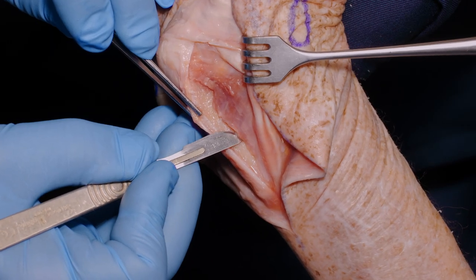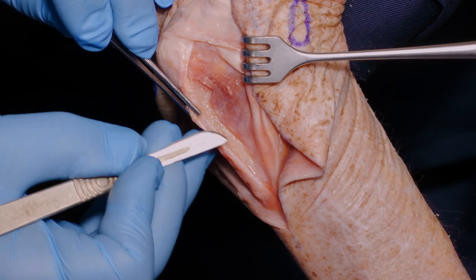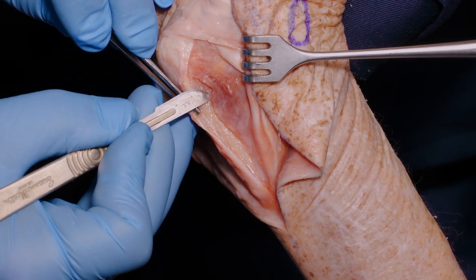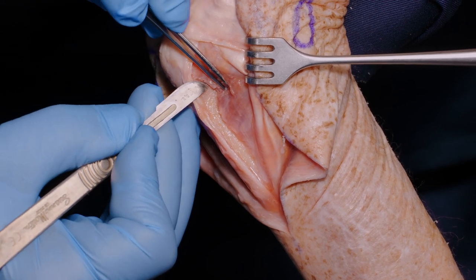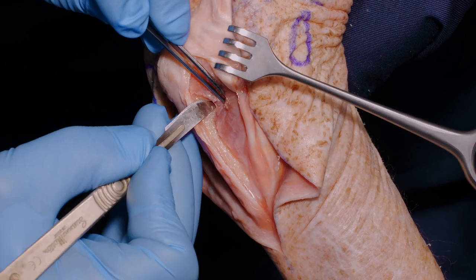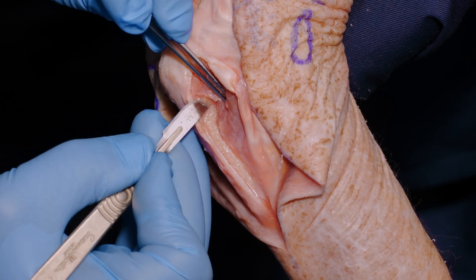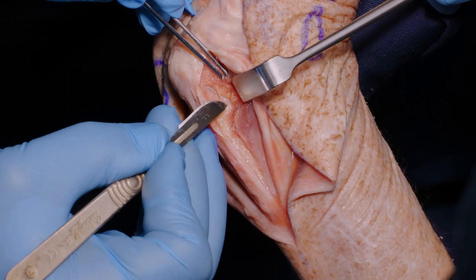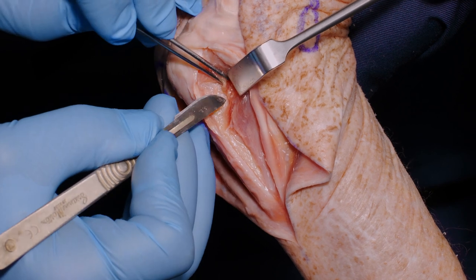Here we are peeling the anconeus sharply off its very strong fibers of attachment to the periosteum of the ulna. In this region we're going to elevate it completely from the capsule in order to perform a capsulotomy before our osteotomy, so that we are clear exactly where our osteotomy is going to enter the trochlear fossa of the proximal ulna.